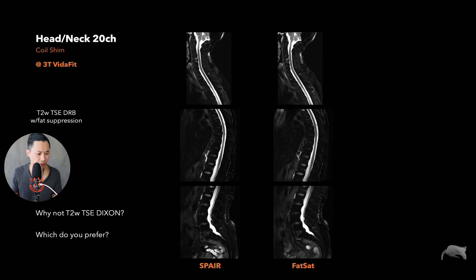Which one do I prefer? I prefer fat sat. Why? Because the quality is equally good, but with SPAIR the TR increases, and when TR increases, scan time increases. So why not use fat sat when it works just as well as shown here? For this case I will always use fat sat. It's always good to test things out, because you hear that you should use SPAIR and not fat sat — but test it on your own system to see if that's really true.